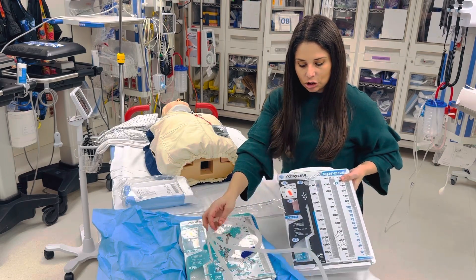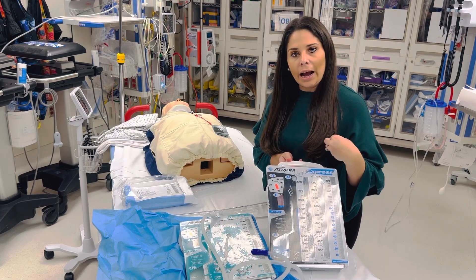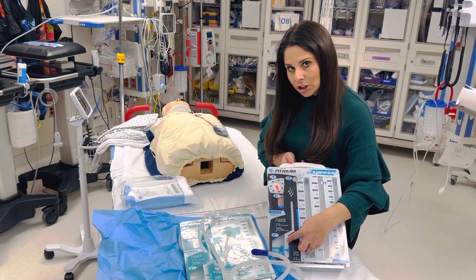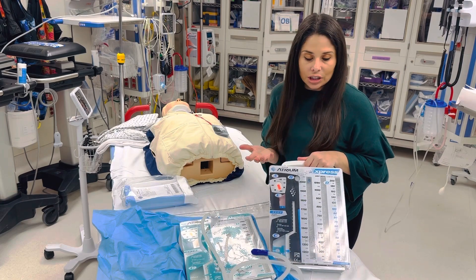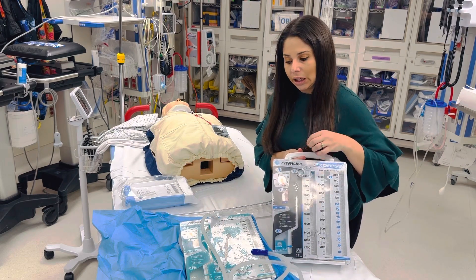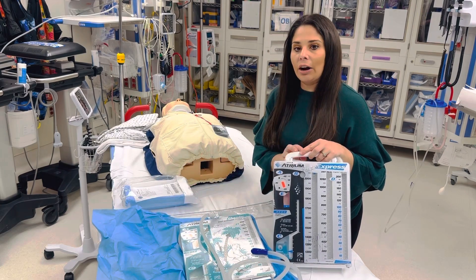A dry seal chest tube works differently — there is a valve in here that when air is pulled out of you, it gets trapped within the valve. So there's actually no need for the water seal chamber, but we still put water in it because it will alert us if there is an air leak. Dry seal chest tubes should not bubble normally, but water seal chest tubes should be bubbling if it's pulling air out of your chest.